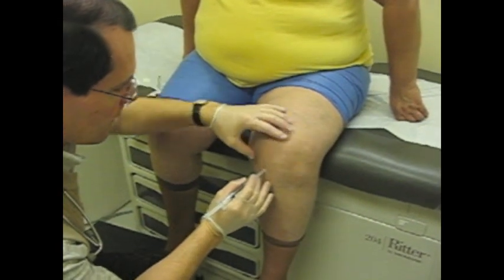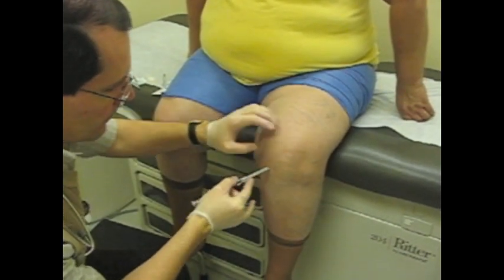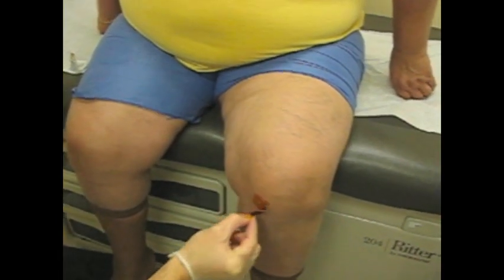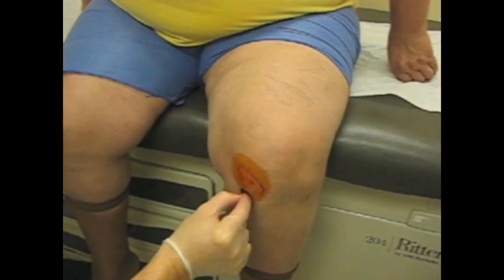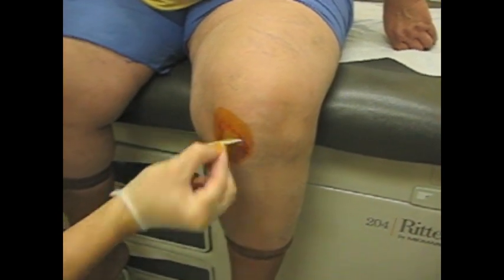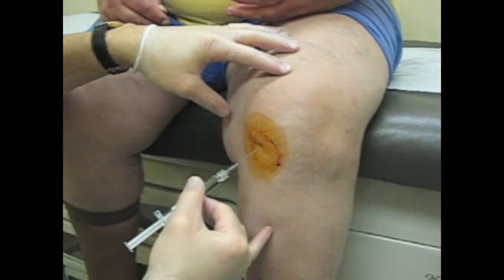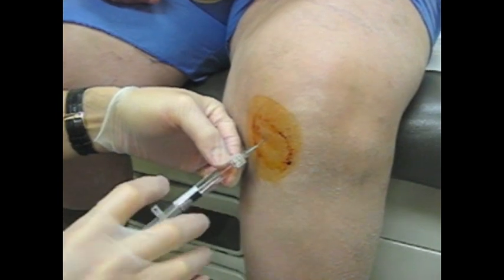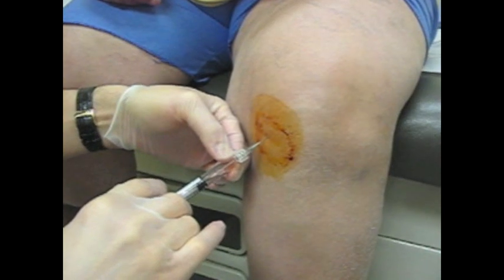Establish the anatomical landmarks, find the injection site, and mark it with the closed end of a needle cap. Clean the area with antiseptic solution twice in an outward spiral motion. Then, dab it with alcohol. Without touching the sterile area of the skin, insert the needle at the previously explained point of insertion. When injecting hyaluronic acid, avoid drawing back on the plunger.